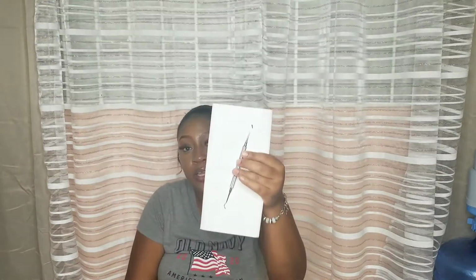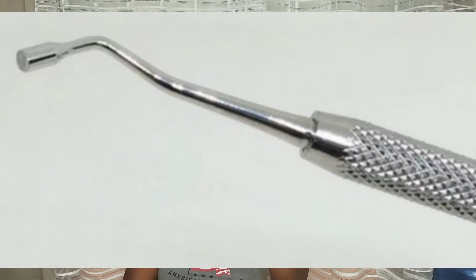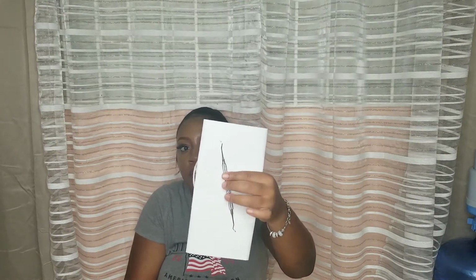So basically, after the carrier, you're going to need this condenser. Yes, this is a condenser. And you're going to use this to press the amalgam into the cavity preparation that you would have just prepared. So you just want to ensure that every crevice and corner is packed with amalgam. So you're going to need this. Now you have different sizes. This one is a tiny one, so it's good because it can fit in basically any cavity preparation. So that's good.